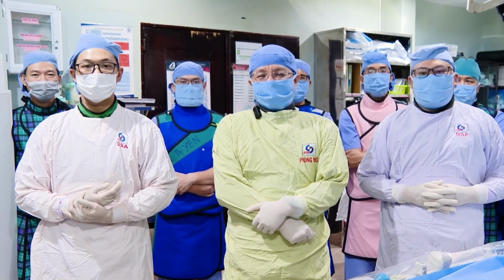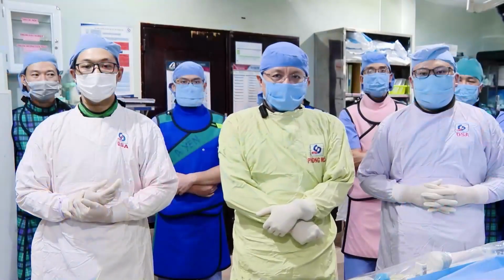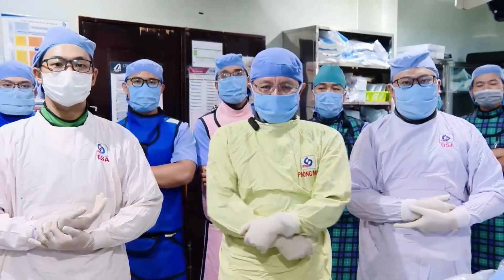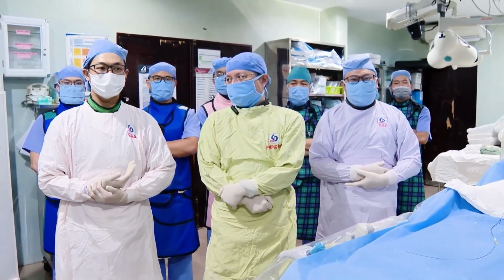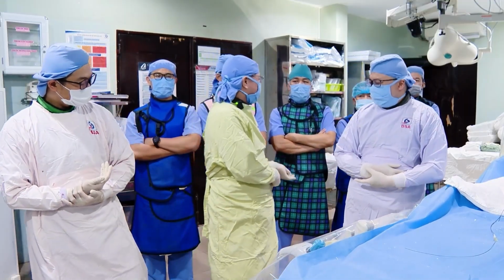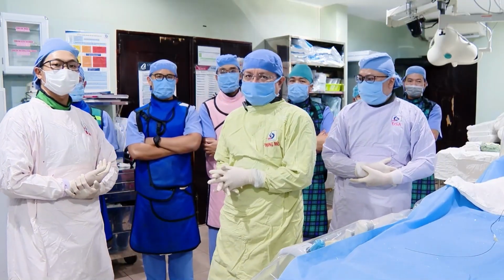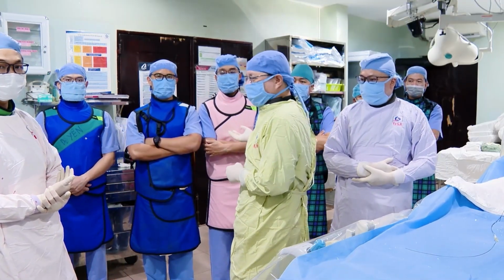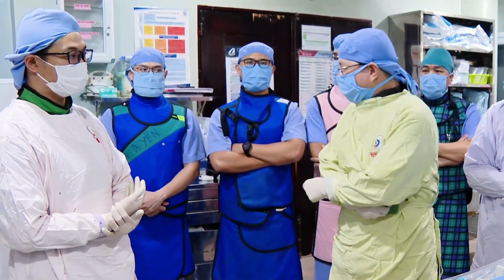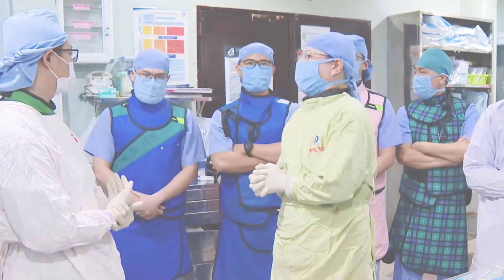Good morning. Welcome to Gia Định Cath Lab. Thank you so much for the opportunity to share with you this PCI case, how to deal with severe calcified lesion. We're here in our room with the fellow Dr. Kane. We have Dr. Tiến, the assistant operator. The staff helping us today are technicians Tú and Long. We also have the IBI team, Dr. Hóa and Dr. Minh, who are in charge of analyzing the OCT and IVUS interpretation. And now, Dr. Quang, let's introduce our case today.